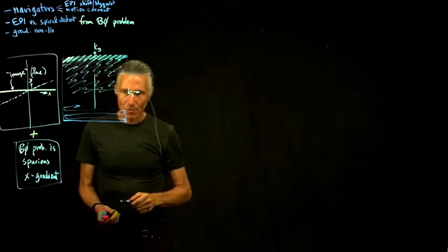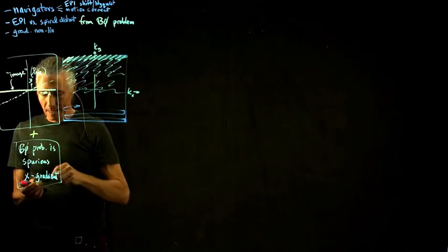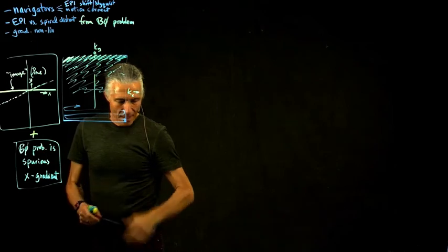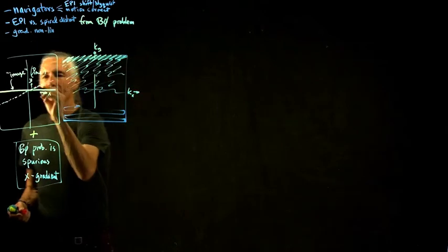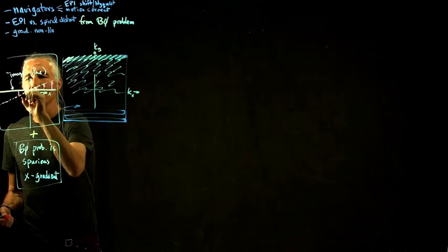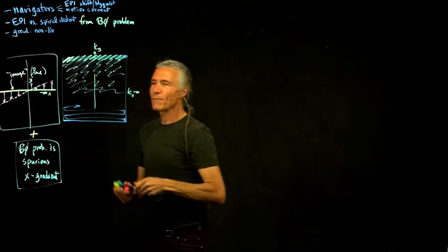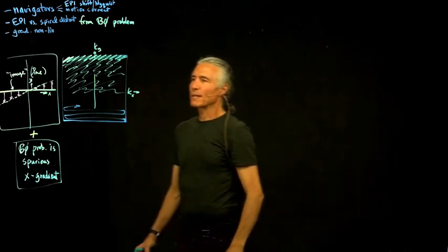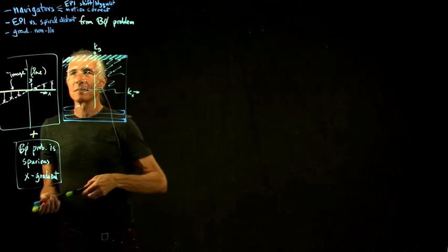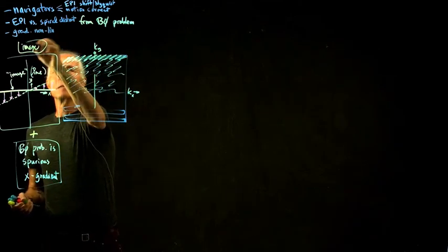So what does that do? Well, what that's going to do in k-space is essentially cause a phase error that is bigger and bigger when you move away from the center of real space. Don't forget, this is image and k-space.